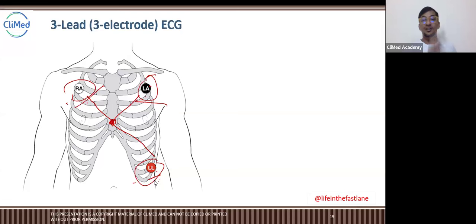Okay, so in ECG monitoring, the patient is already intubated and there are many things attached, like maybe the intubation, or the catheters and maybe the Ryle's tube or whatever, and injections and multiple things are there, right? So we need minimum coverage of the body, so we need just 3 leads or 5 leads in the intensive care units. Okay, so this is the 3-lead ECG.